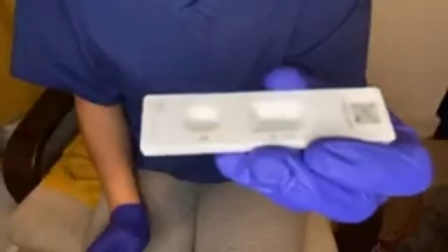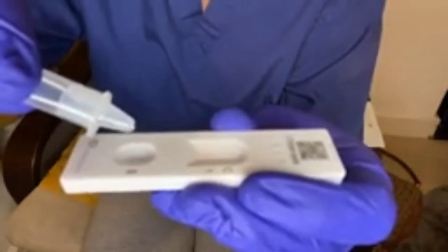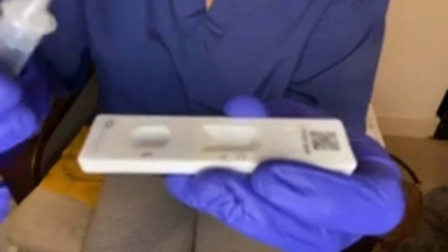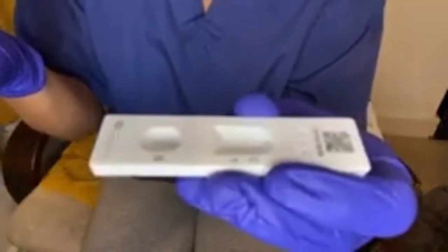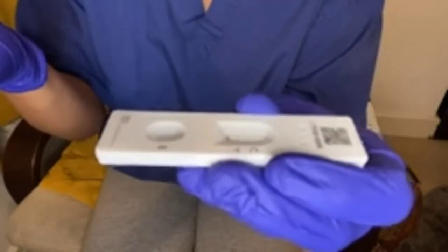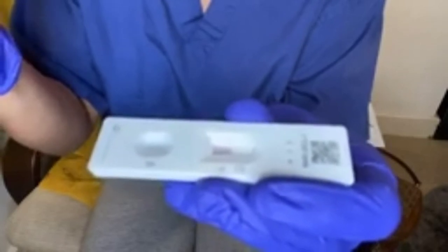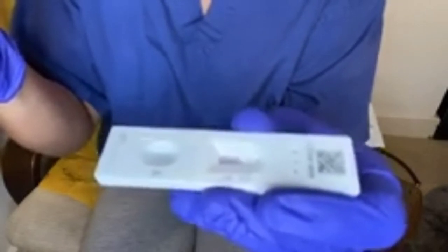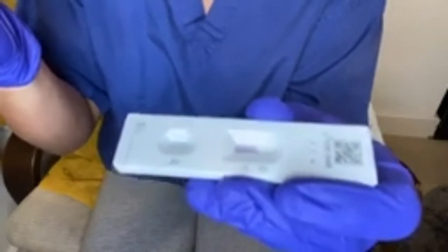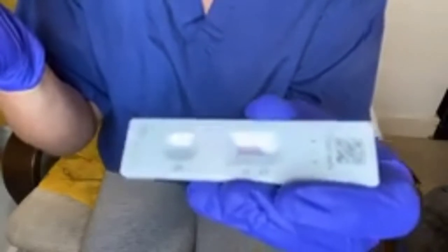Pour at least 2 drops of the solution into the cartridge — 1, 2 — and then wait 30 minutes to get the result. If you get 2 lines at C and T, it means you are positive and you have COVID. If you only get 1 line, it means negative. Just like a pregnancy test — if you get a faded T line along with the C line, it's still positive. If only 1 line is showing, it means negative.